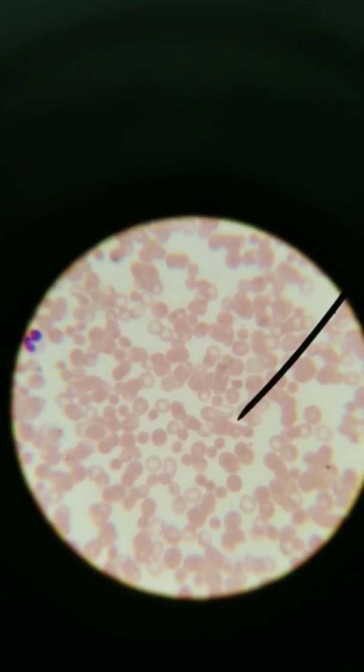Hey all, we are taking a look at erythrocytes, red blood cells, what normal ones look like and what irregular ones look like, ones in different forms of anemia. Anemia is a set of many different possible conditions where there could be something wrong with the red blood cells or you have low amounts of red blood cells, basically leading to low blood oxygen.